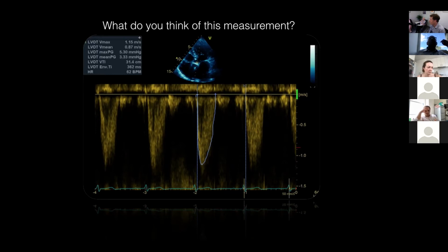It can be easy to lose, but it's the only way that you're going to find that you're in the right place. It's the closing click. Down below, if you haven't got it, it means that you're too far away from it, or you haven't got the best angle possible.